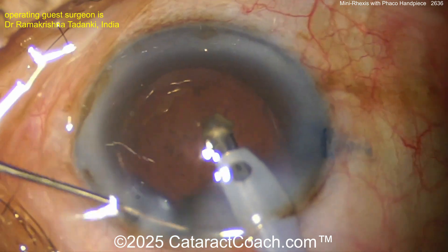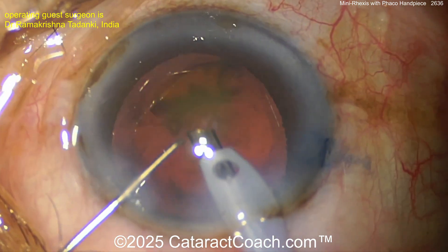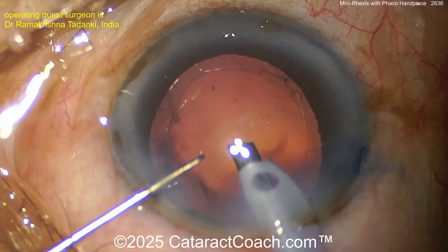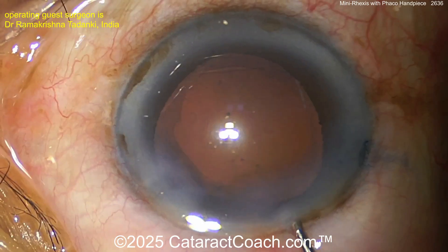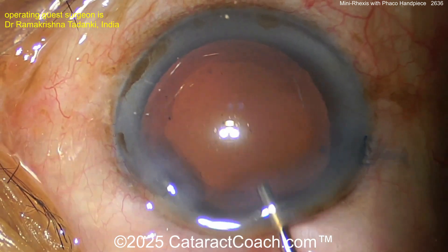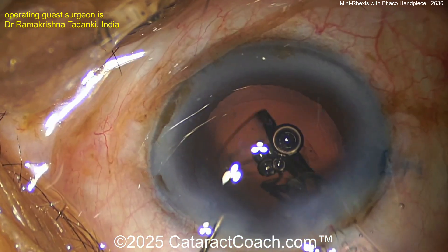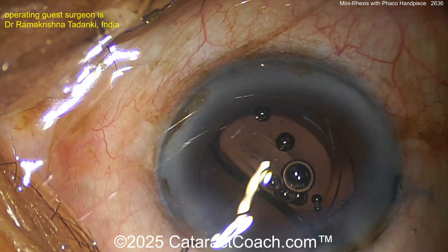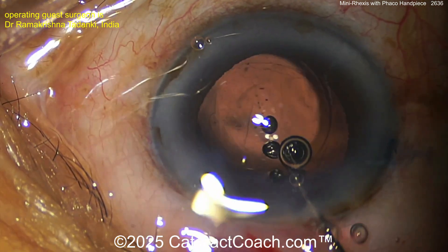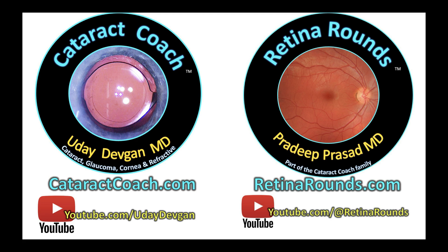Here's the last bit of nucleus coming up — notice there's no cortex, as it was all liquefied and removed earlier. Clean-looking case. This patient is obviously going to be super happy going from what was probably light-perception vision to normal vision after a beautiful surgery like this. Here comes a single-piece acrylic lens going into the capsular bag — beautiful result. Thanks for sharing the video.